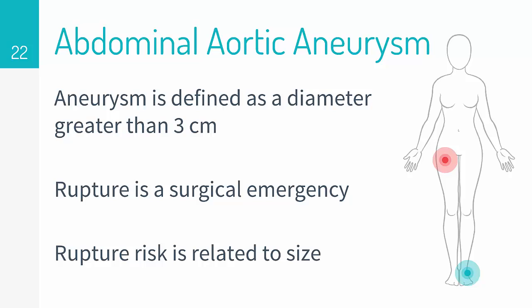Mortality is directly related to the time of diagnosis, making this a critical must-not-miss finding in unstable patients. And as we know, these patients often cannot go to CT scan due to their instability, making rapid bedside assessment with ultrasound a vital tool.